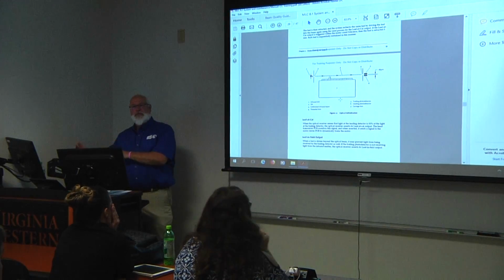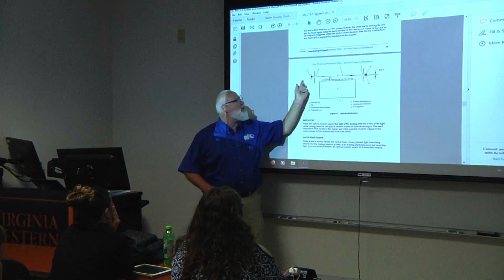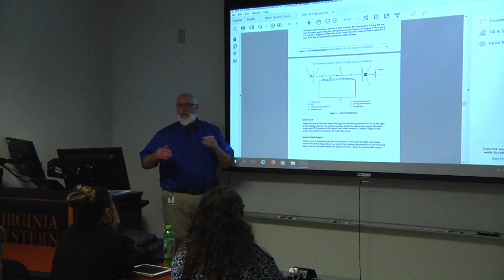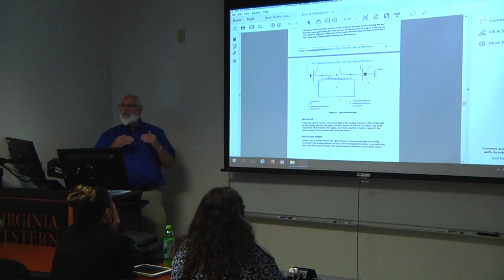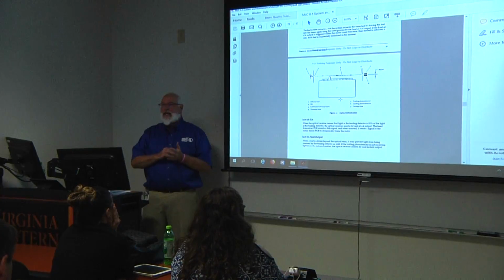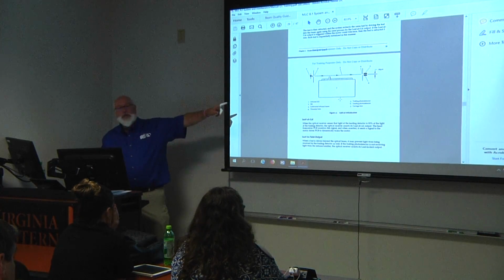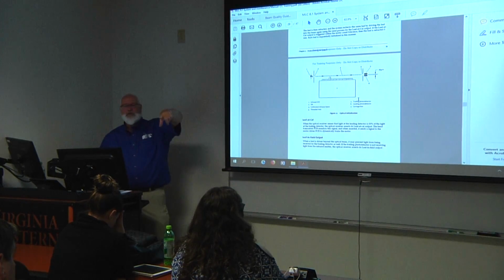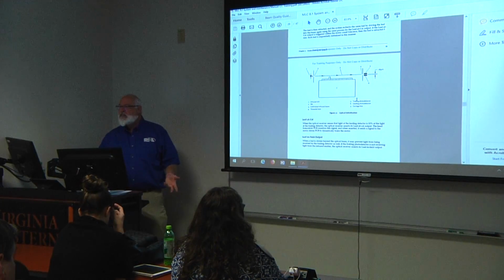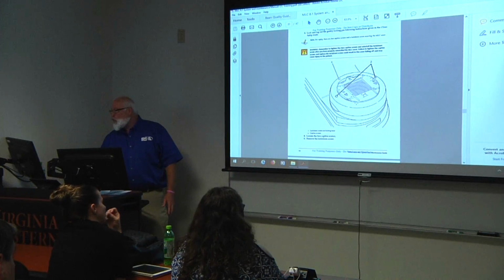So then we go back to a physics test or check. Anytime we change any components in this system, that means your leaf position is now different, or it needs to be verified that we put it back in the same spot. So that's what happens every time you initialize in the morning. It's just doing a quick check to make sure that your MLC leaf positioning is accurate. So let's go back in the room.